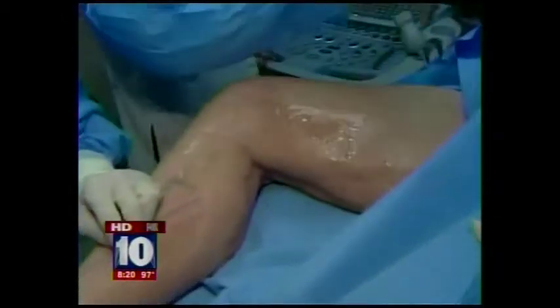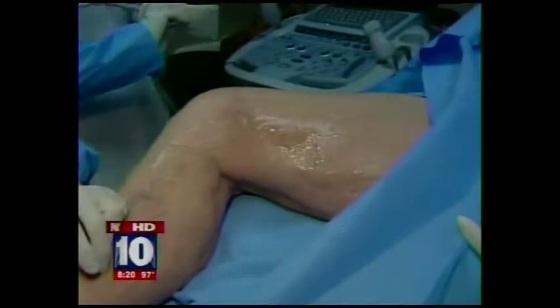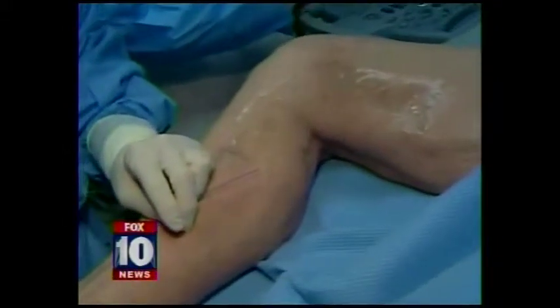We're looking at some of the veins here — and we thank you, Ginger, for being our patient this morning. With this machine, we're treating the underlying veins — not the big important deep ones, but the superficial veins. For those smaller surface veins, we come back and do traditional sclerotherapy. But what's feeding all of these is the underlying veins, and that's what we're destroying now.